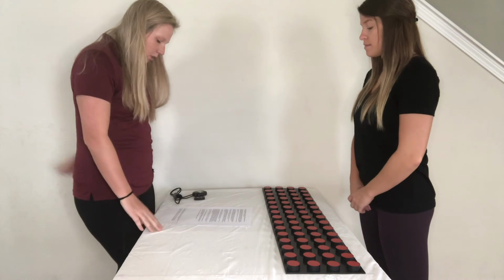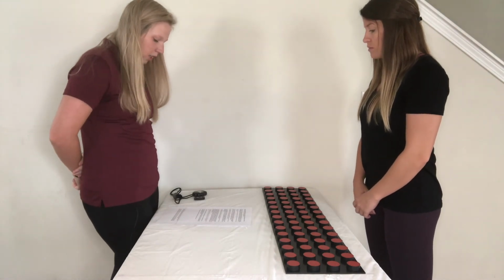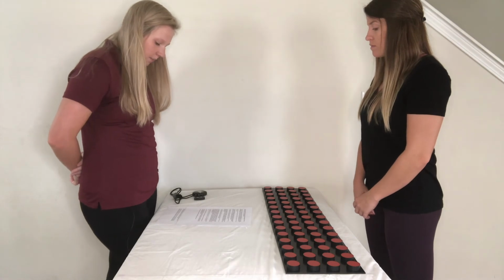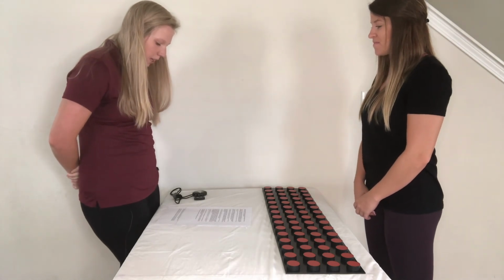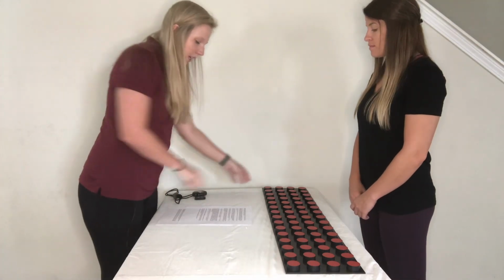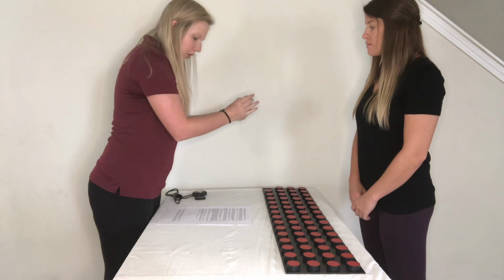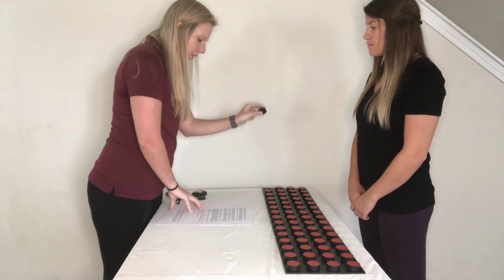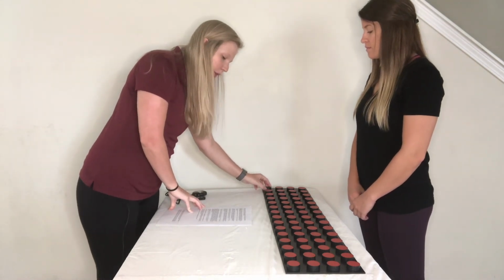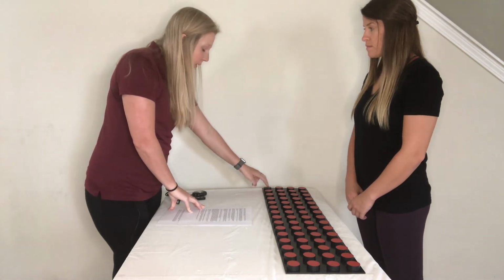You will now be doing the turning test. The object of this test is to see how fast you can pick up the discs with one hand, turn them with the other hand, and replace the discs back into the holes on the board. With your left hand, you will pick up the block from the upper right-hand corner. You will turn the disc while passing it to your right hand and return it into the original hole in the board with the bottom side facing up, which for you is black.